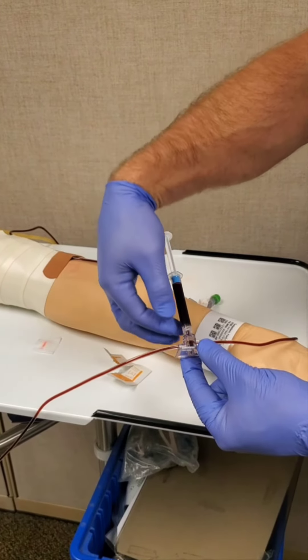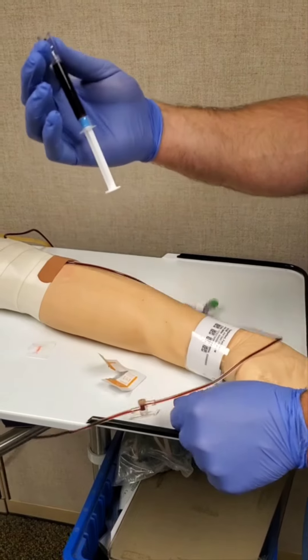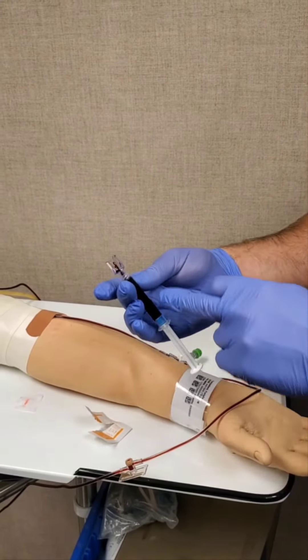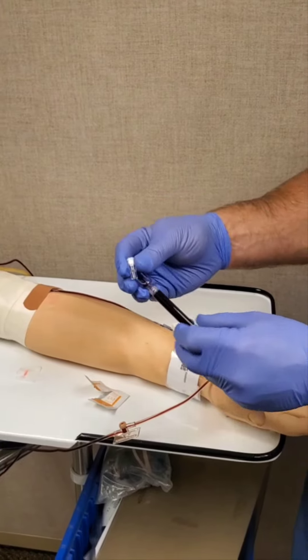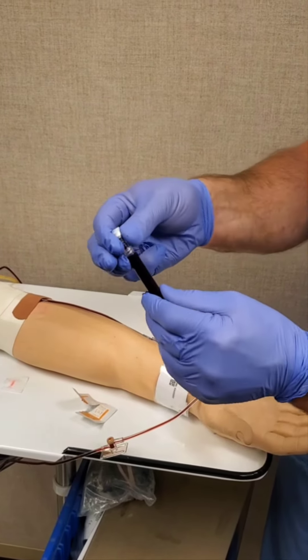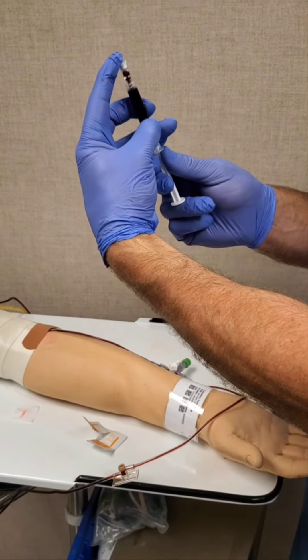When removing the syringe, pull the cannula with the syringe. Removing the syringe without the cannula will result in blood flowing out of the port. Once removed, remove the cannula and put the topper on the ABG syringe and fill it with blood.